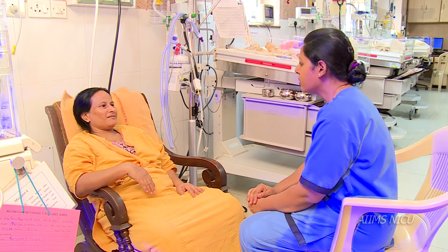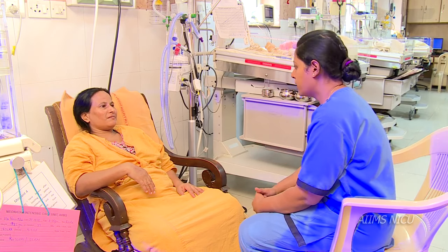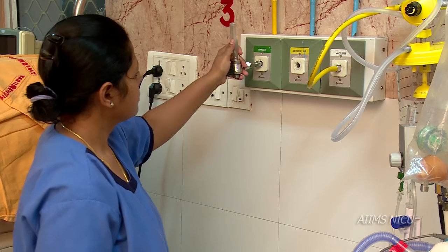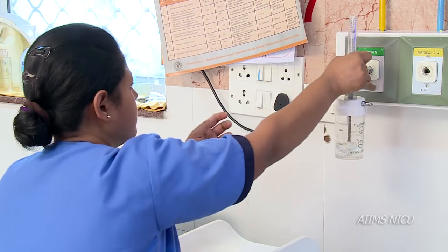Counsel parents before starting oxygen therapy and always ensure asepsis throughout the process. Attach the flow meter to the oxygen cylinder or to the central oxygen supply and start the oxygen flow.